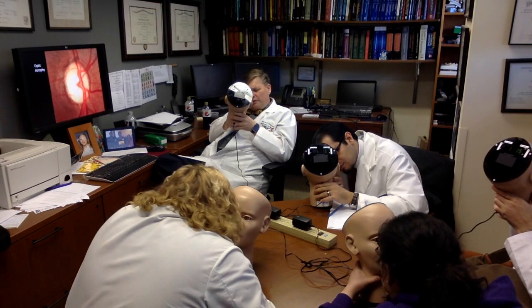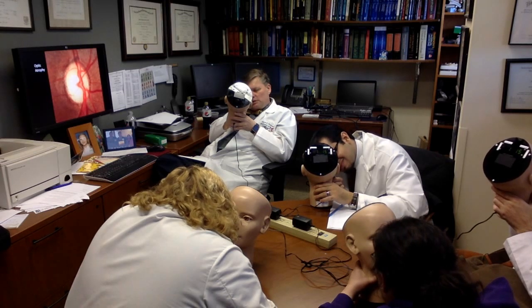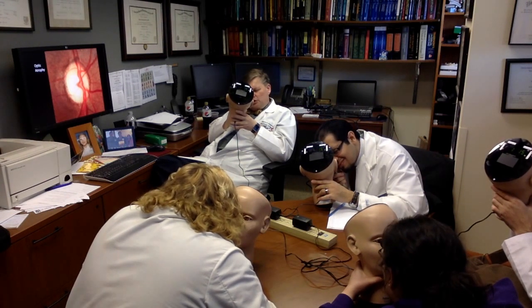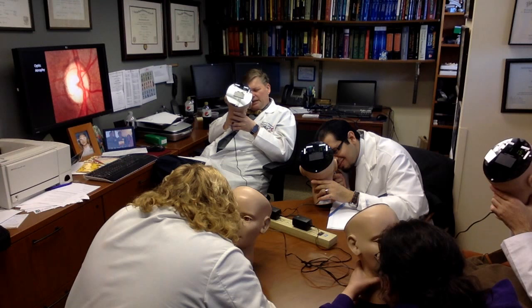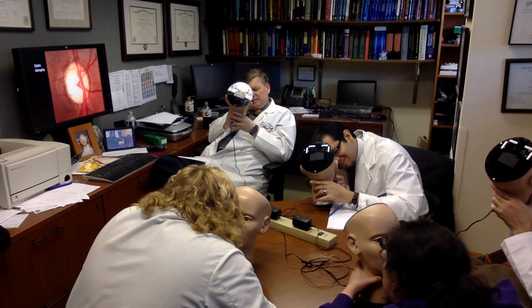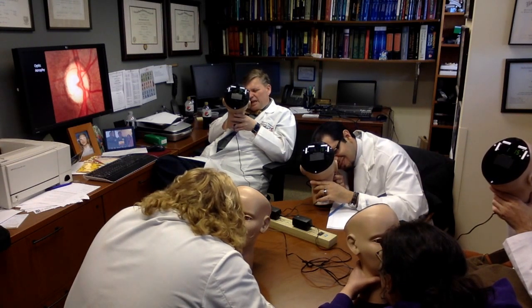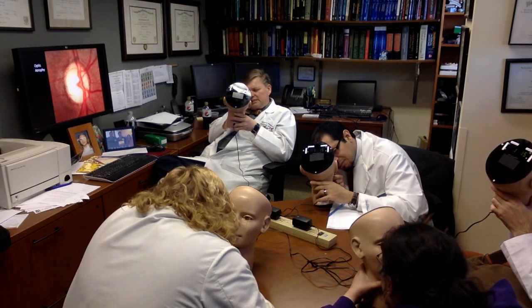And if you follow one out roughly about 9 o'clock, about one disc diameter to the left, you'll see this flame-shaped hemorrhage. Everyone see that? If you follow the tortuous vein down at approximately 7 o'clock, 7:30 or so, and go down past its bend, you'll see 3 flame-shaped hemorrhages there. 1, 2, 3. Now start to look to the left and look into the retina, and what do you see? You see all these hemorrhages, all these dots and blots. You see them on the below, you see them on the middle, you see them on the top. There are multiple retinal hemorrhages everywhere. Dot and blot, flame-shaped hemorrhages, as well as these cotton wool spots.